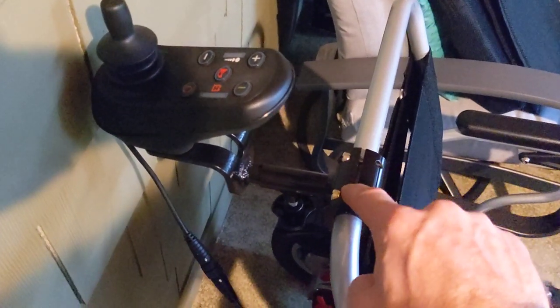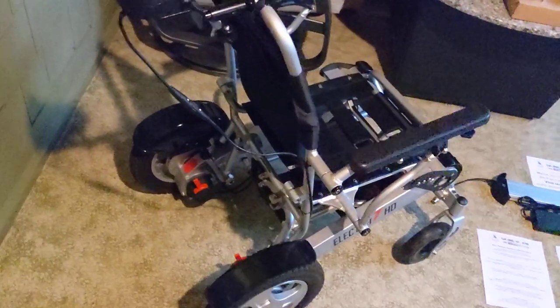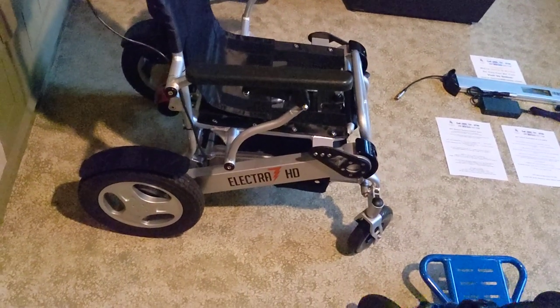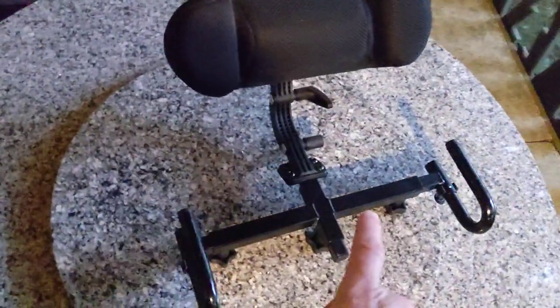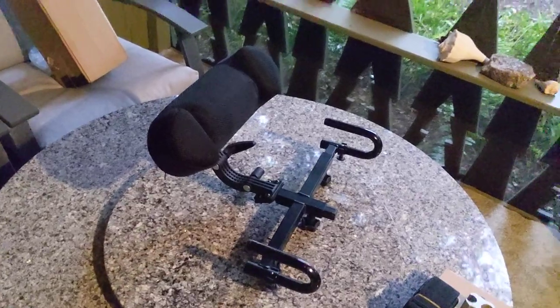Another really unique feature is the attendant controller bracket — you can see on the Electra 7 that you can mount the joystick to the back of the chair. An attendant can very easily use the chair this way. This has been great for taking grandma around the neighborhood — she loves to get outside but isn't comfortable operating the chair on her own. With the attendant controller bracket, we can take her on a long walk without being hunched over pushing. We also have the headrest option: it attaches right to the back of the chair, is completely adjustable, and uses the same memory foam and breathable material.